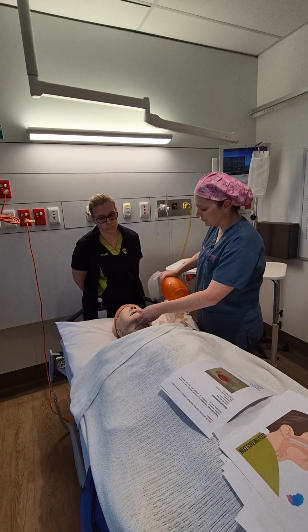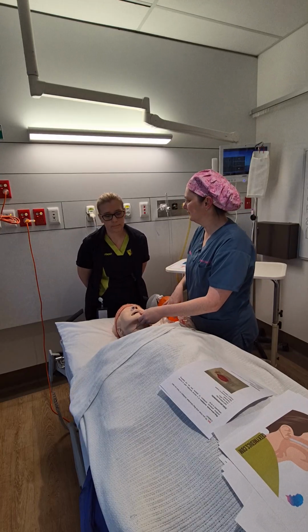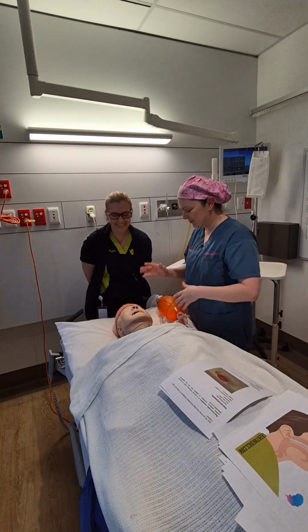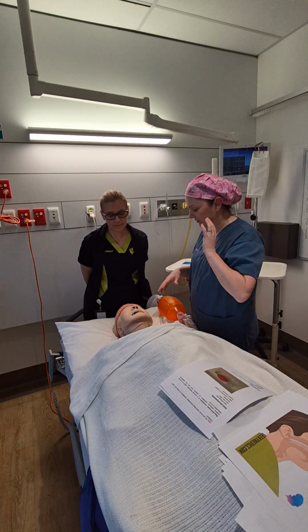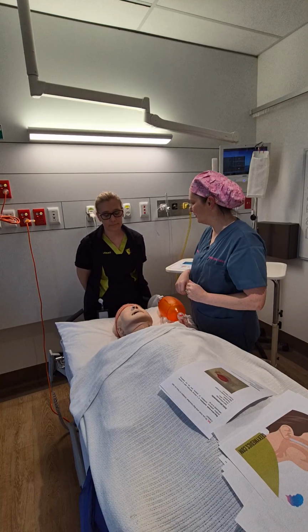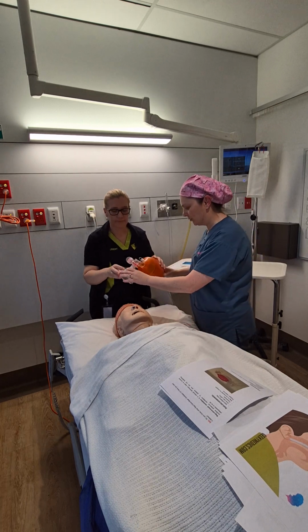So do you know what the average respiratory rate for an adult is? I do, but it's gone. 12 to 20. So if we aim for a respiratory rate of about 12, that's fine. So generally what we say if we're doing a resus is, when you take a breath, give a breath. Wonderful. So I'll get you to have a go at putting the mask on.